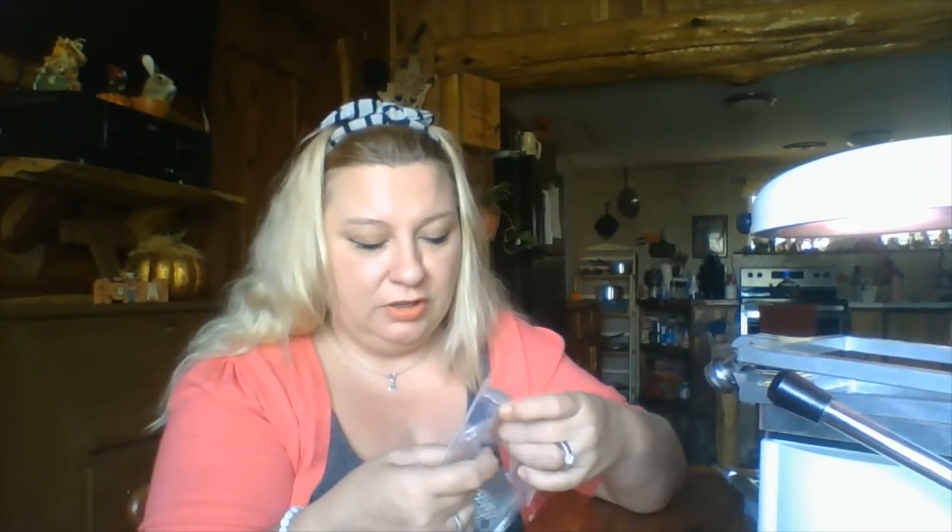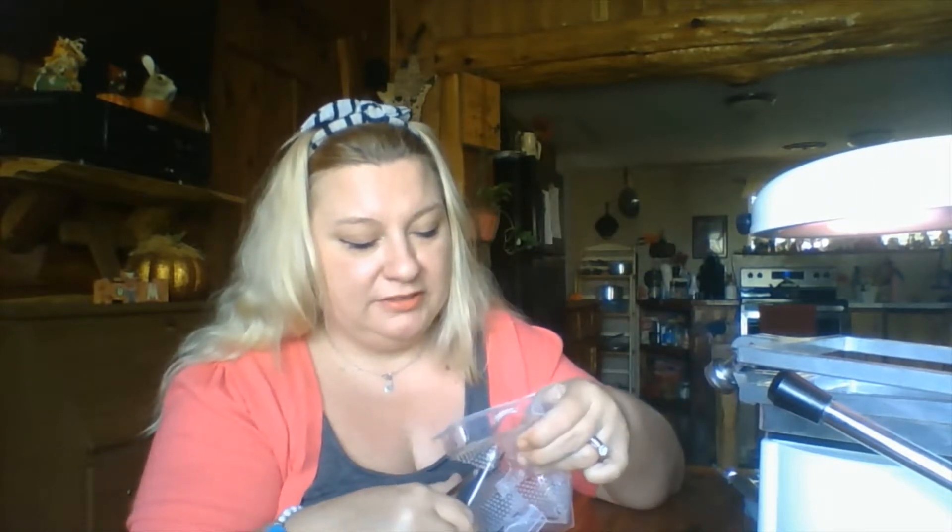Once you have it where you can pull it out, seven out of ten times the model's going to break. But if it doesn't break, save it or give it to your patient. Some offices don't want an overload of models in their lab, or some keep them and charge the patient a smaller fee for a replacement if they lose their tray. So I've cut it out — now I'm going to trim it and trim all the excess off.